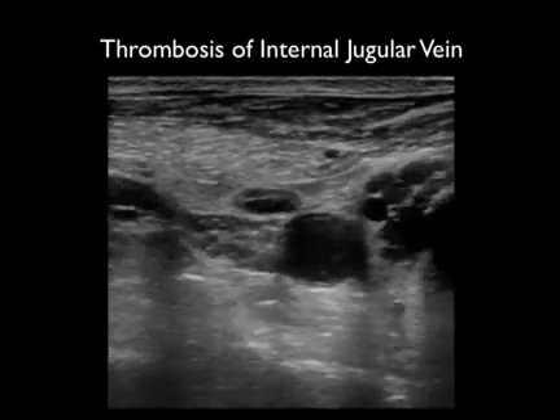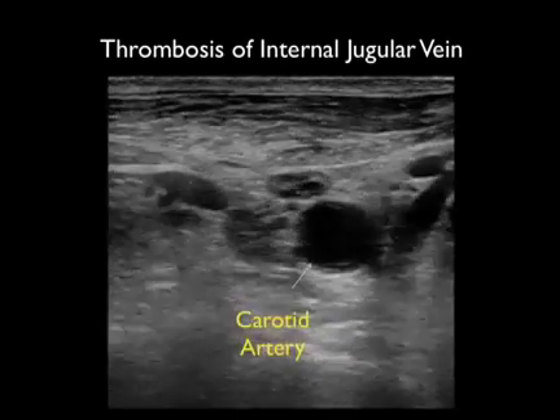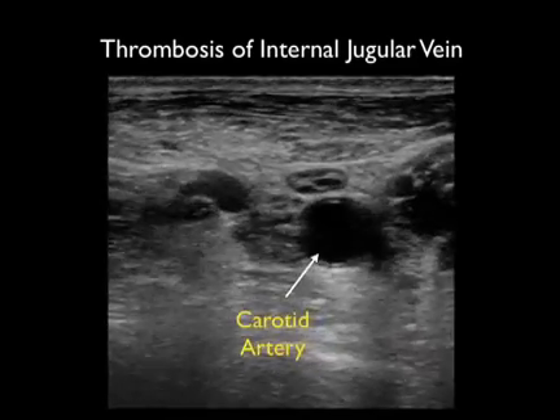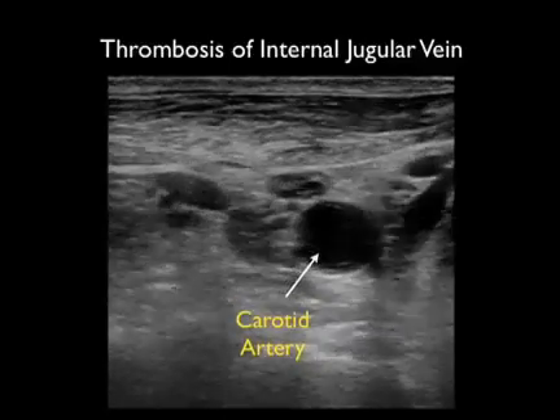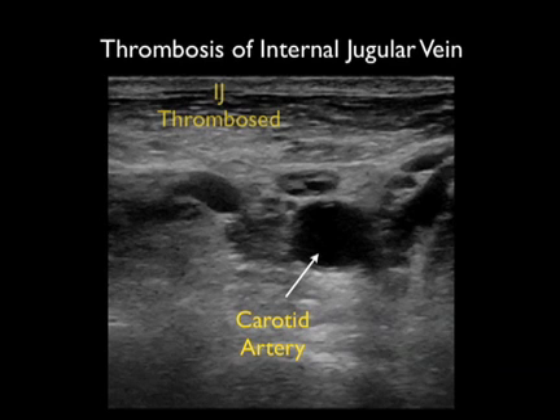Let's end this module with a possible pitfall that can be avoided by first looking with ultrasound. Here we have a patient who has had a prior central line, and we notice a thrombosed internal jugular vein with echogenic material on top of the carotid artery. When we push down with the probe, the internal jugular vein fails to compress. In this patient it would be best to look for an alternative area for puncture of a central line.